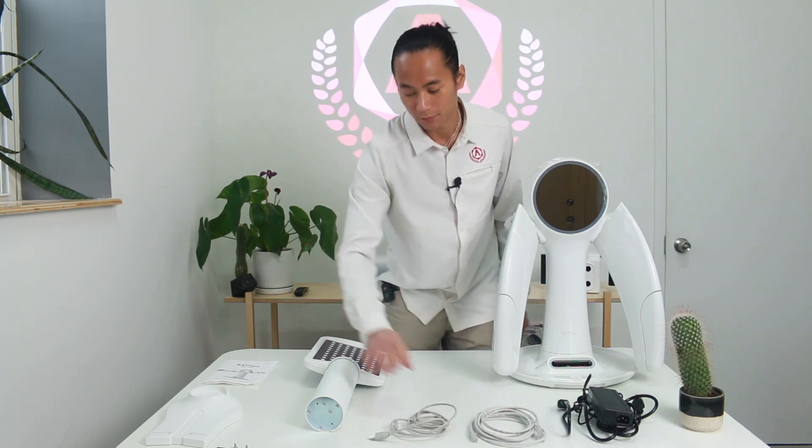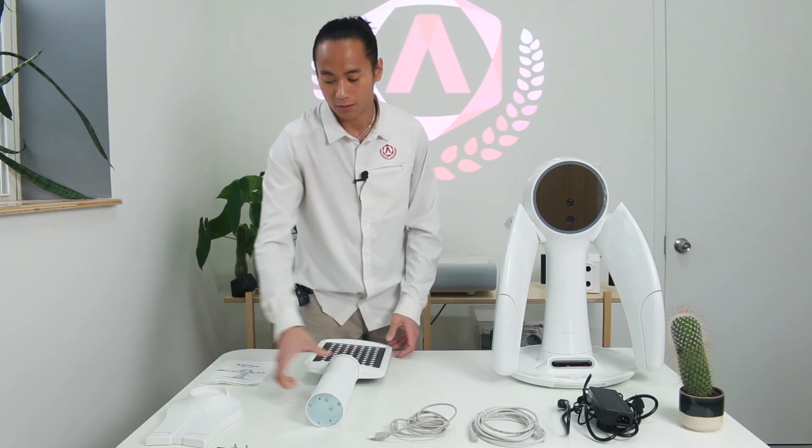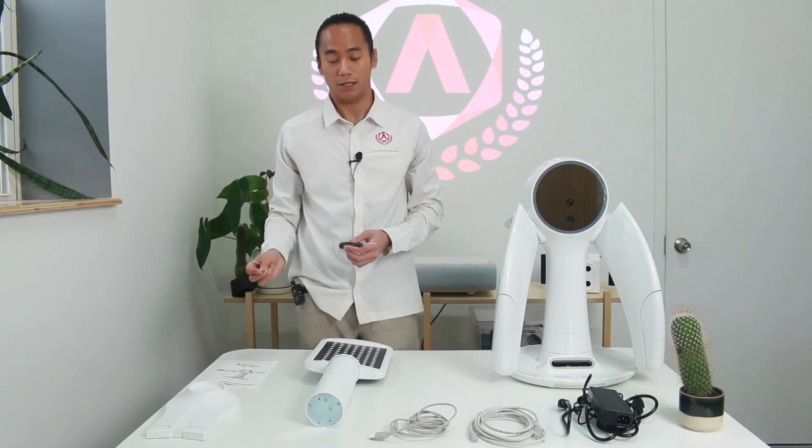Once everything has been unboxed, here are all the contents: your scanner, the scanner's power cable, the Ethernet cord, the USB cable, the calibration plate, the calibration stand, and a screwdriver and screws to attach the stand to the plate.